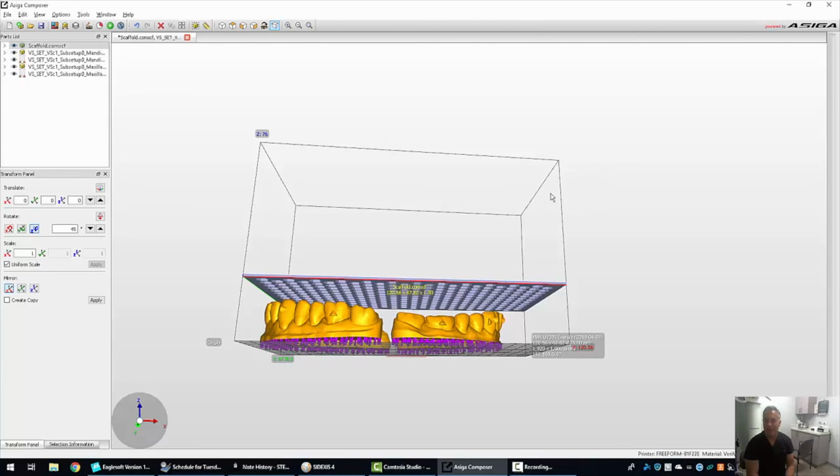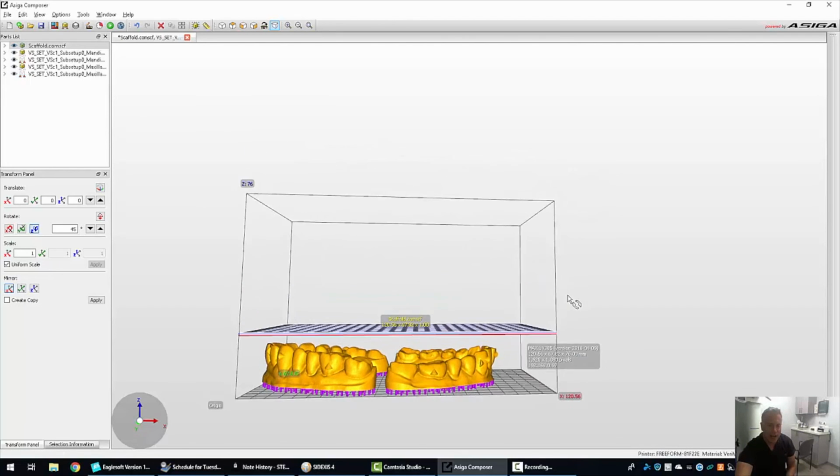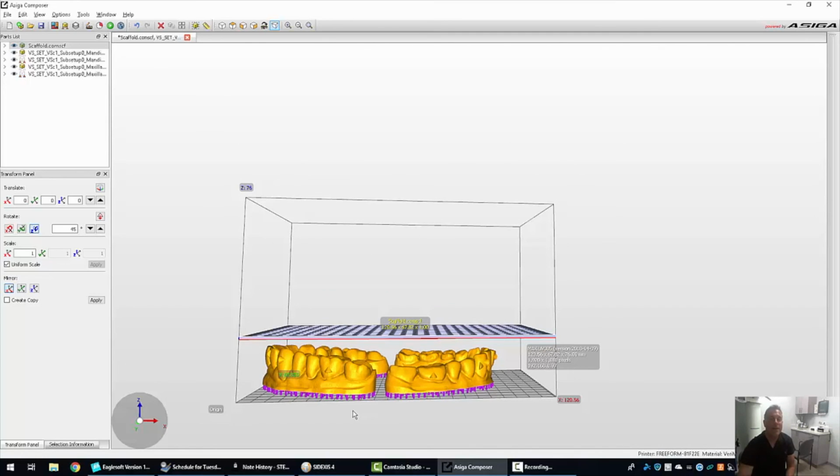However, I can see a number of problems with it. One, I'm going to have to generate this sort of shelf and supports for the shelf. That's going to cost money. But think about this. Everyone is obsessed by printing vertically. And I print all my models horizontally. Why is that? Well, let's think about this.